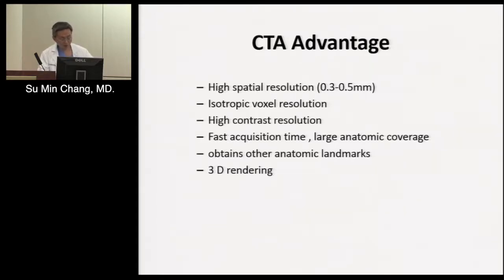Then there's 3D rendering. I'm going to show you some images. Again, I think it's one of the most powerful display tools CT has. It's a truly 3D technique. From a diagnostic standpoint it's sometimes useful, but it's very useful from a procedural standpoint to have the true anatomical representation of how the surgeon sees it.